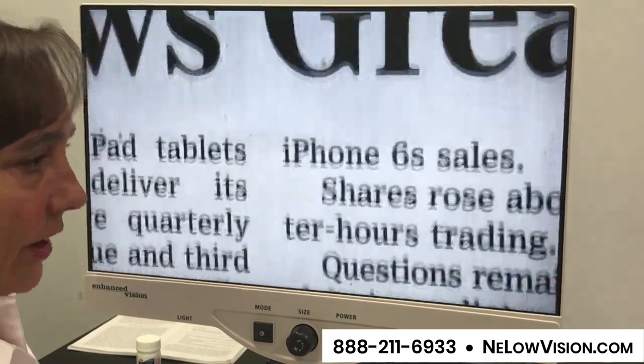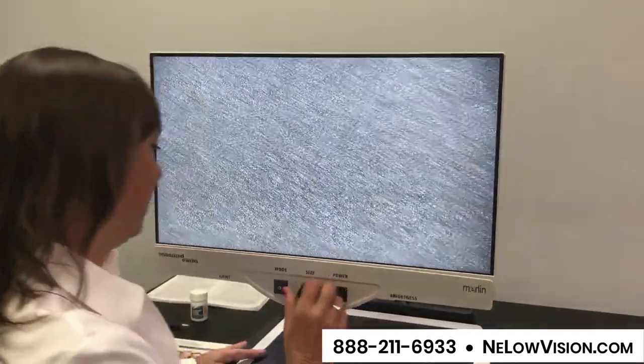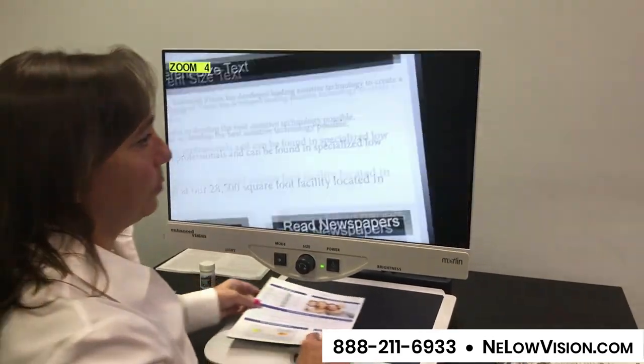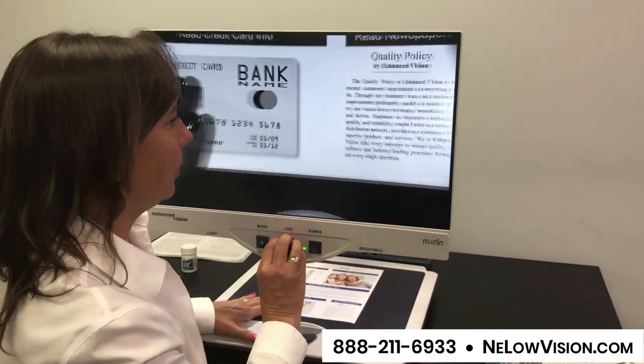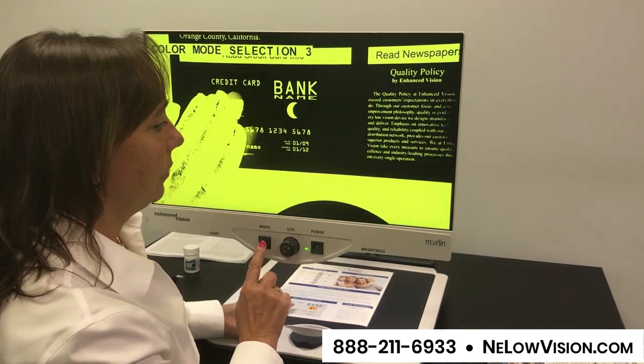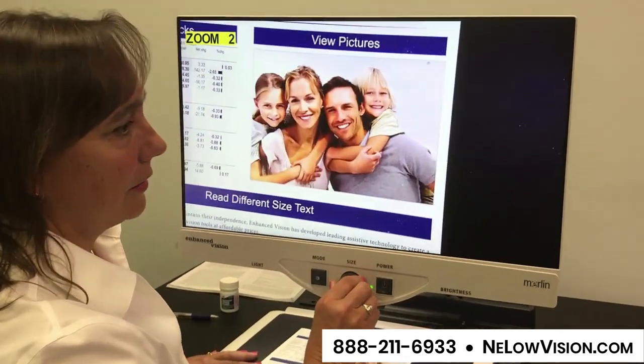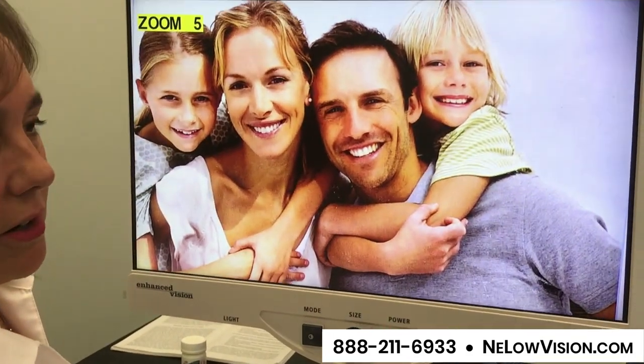We've got a nice XY table here, so that's going to help you navigate around your newspapers and your documents. I'm going to put some more print underneath here. We're going to get back into color mode simply by pressing the button, and you're going to be able to see photos again, postcards, birthday cards.